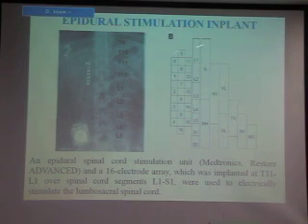And this is a schematic that is not very precise, but what it tells us is that there are different parts of the array that should target different muscles. Briefly, the caudal portion of the array should target the more caudal or the more distal leg muscles, while the more proximal part of the array should influence the more proximal thigh muscles.